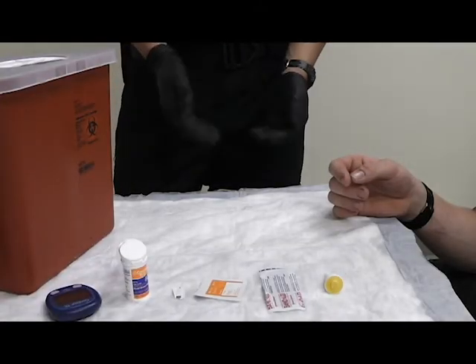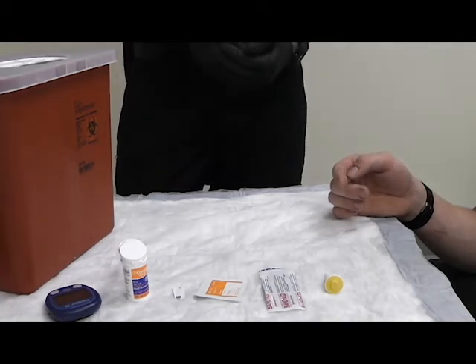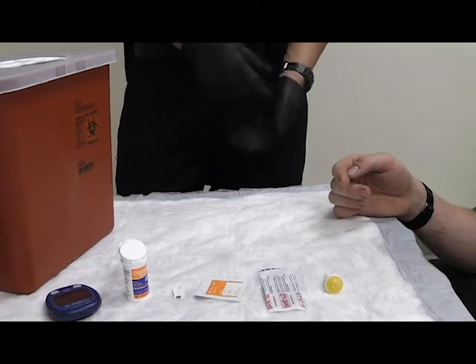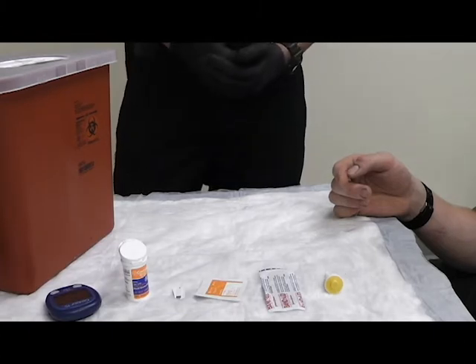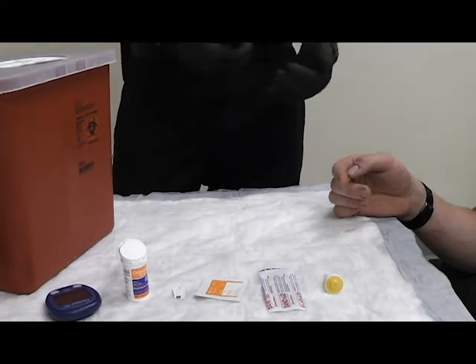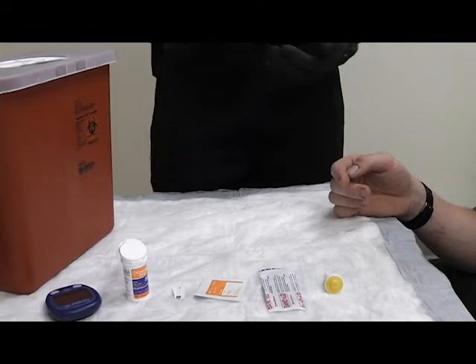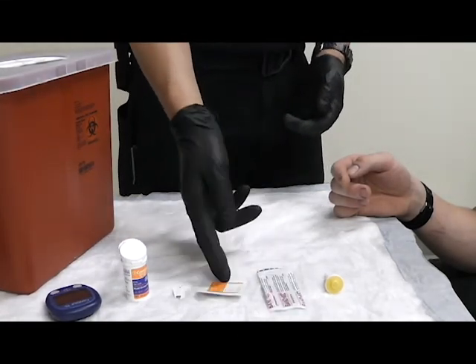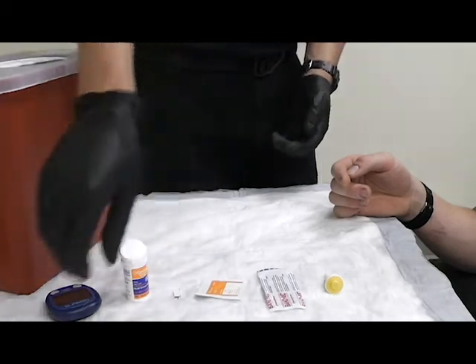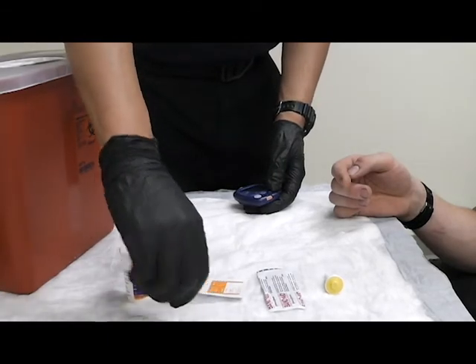This is a demonstration of blood glucose testing using a manual glucometer. Start by using scene safety and having your gloves on. Verbalize the need to obtain a blood glucose for this patient, then ask the patient's permission: 'Is it okay if we take a little bit of blood from you today to get your blood sugar?' After getting permission, prep all your equipment: you need your lancet, bandage, prep swab, testing strips, and your glucometer. Insert your test strip into your glucometer to make sure it's functioning properly.